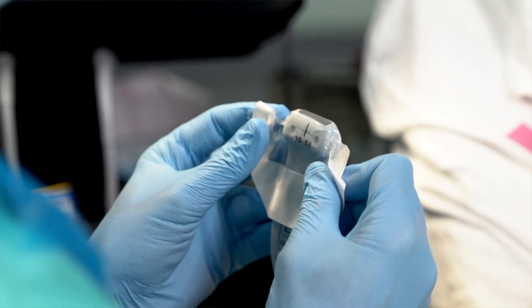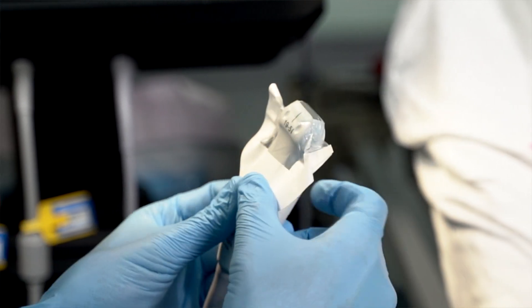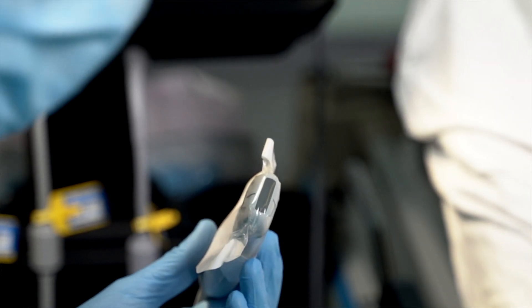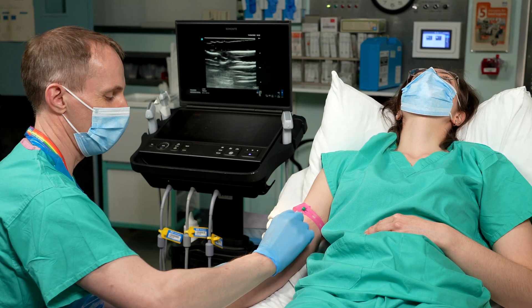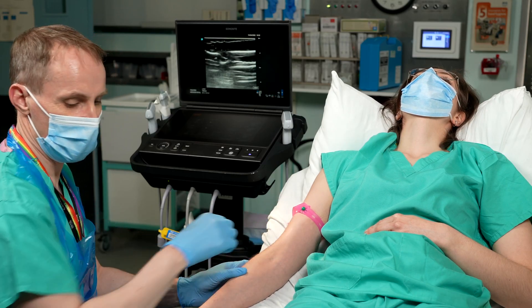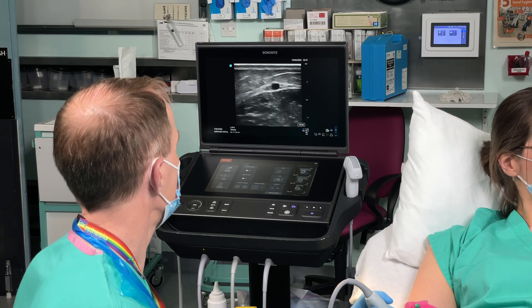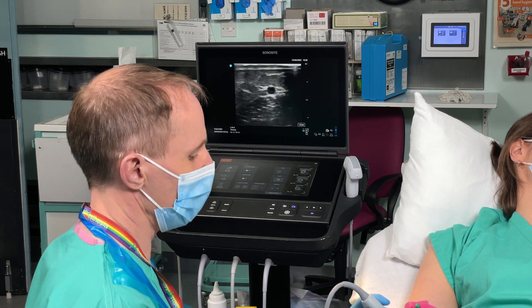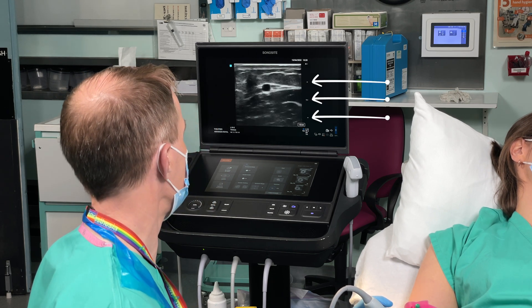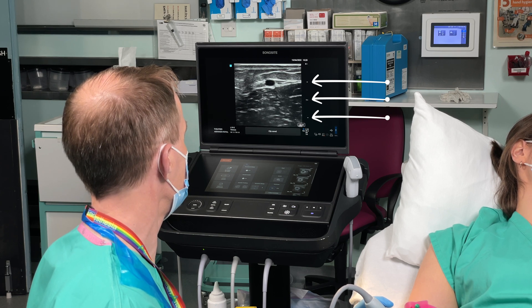Make sure you clean your ultrasound machine before and after use and use a protective sheath to avoid soiling of the probe. There have been reported instances of bloodborne virus transmission as a result of contaminated ultrasound probes. Clean the skin as normal, set up your ultrasound, and orientate the probe. Get your target vessel in the middle of the screen, align it with the markings for the middle of the probe, and estimate the depth using the markings down the side of the screen. The optimal place to have your vessel is right in the middle of the screen.